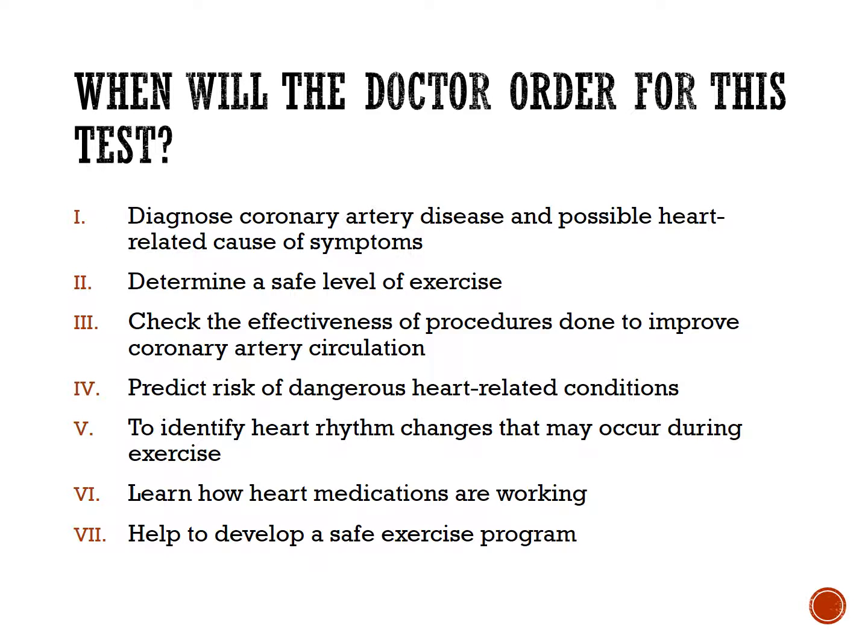So when will the doctor order this exercise stress test? Usually if the doctor wants to diagnose coronary artery disease and the possible heart-related cause of symptoms, to determine the safe level of exercise, to check the effectiveness of procedures done to improve coronary artery circulation, to predict the risk of dangerous heart-related conditions, to identify heart rhythm changes, to learn how the heart medication given to the patient is working, and to help develop a safe exercise program.